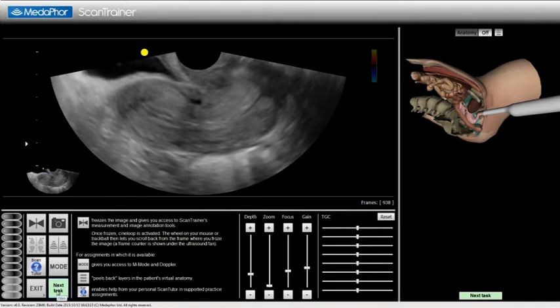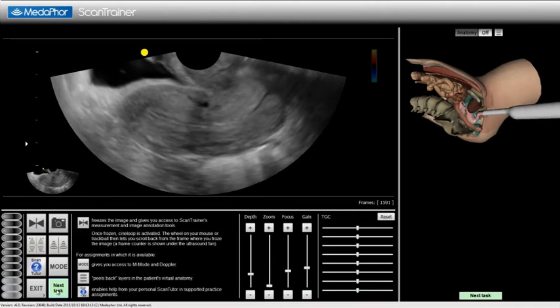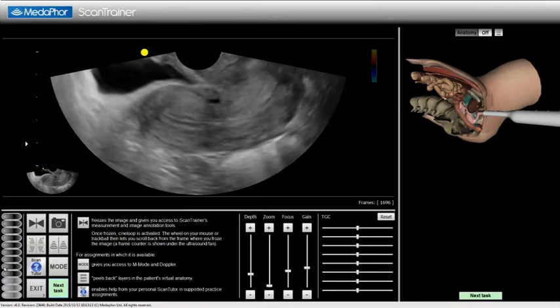Optimize an image of the endometrium in its maximal thickness. Remaining in the sagittal plane, I demonstrate the whole length of the endometrium and the cervical canal, showing the endometrium in its maximum thickness. I ensure that the endometrium and the ultrasound beam are perpendicular.